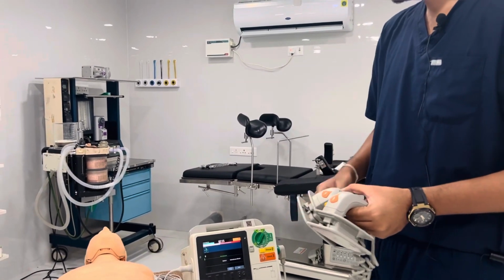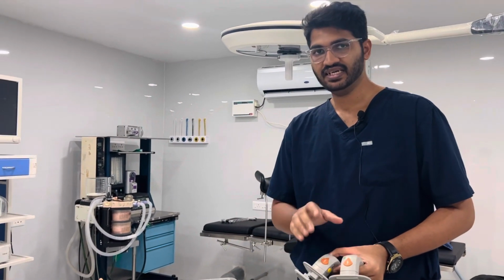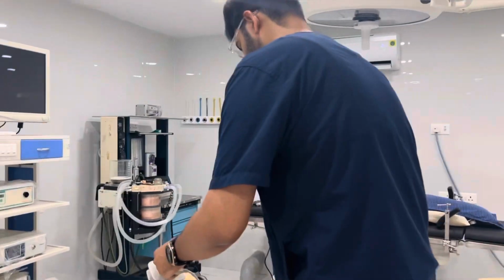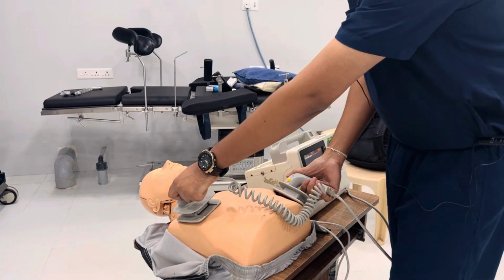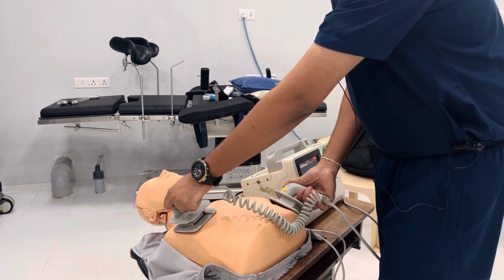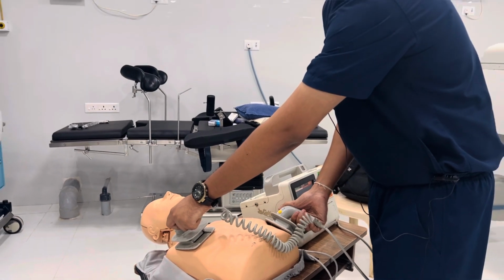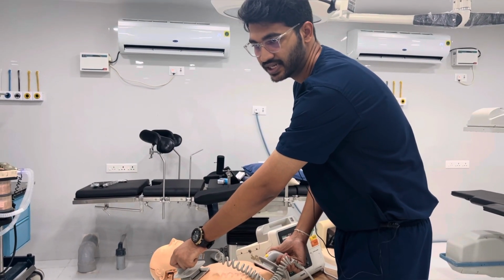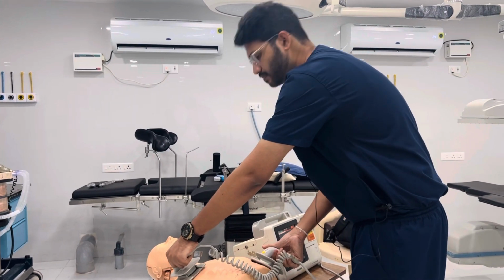After selecting the joules, in case of pulseless VT or VF, we don't need to press sync. You can directly defibrillate the patient. Apply the paddles, one at the apex and one at the sternum, and then give a shock. Before delivering a shock, please ensure that your colleagues are not touching the patient or the bed. You should loudly say "clear" and make sure everyone is clear. Then you press the shock.